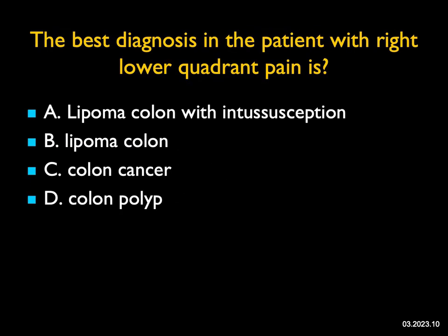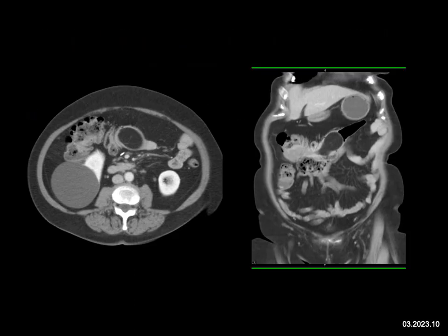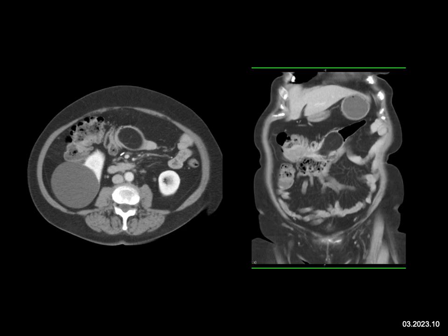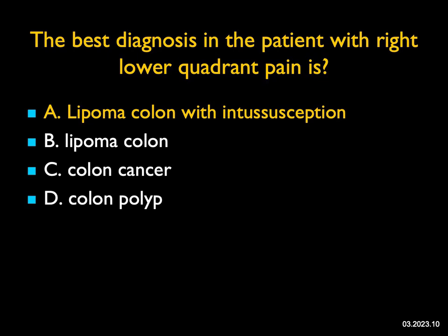The best diagnosis in this patient with right lower quadrant pain — on axial images there's a big soft tissue mass with fat attenuation compared to subcutaneous or intra-abdominal fat, about 4 cm. On the coronal view, you can see it's in the colon and the right colon is intussuscepted upward. This lipoma began in the region of the cecum and then intussuscepted to the mid-transverse colon. The diagnosis is a lipoma in the colon — not colon cancer, and technically a polyp by definition, but more precisely a lipoma with intussusception.